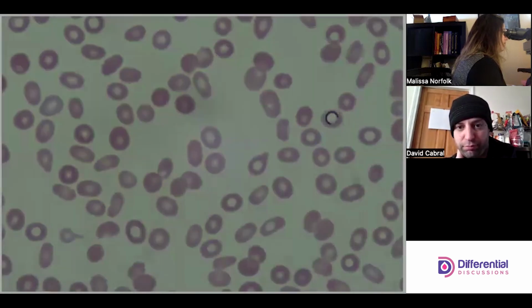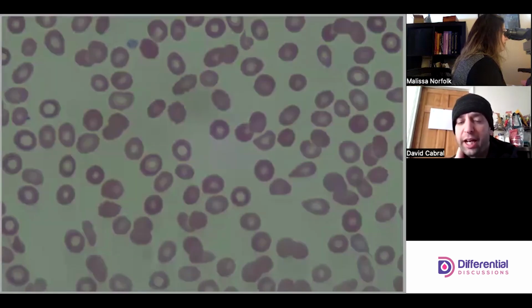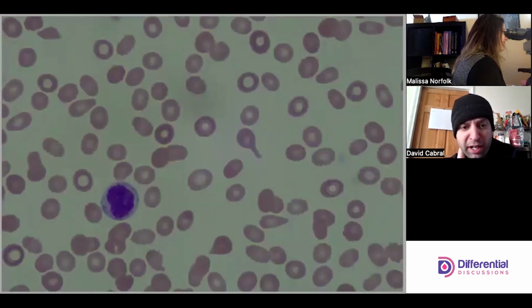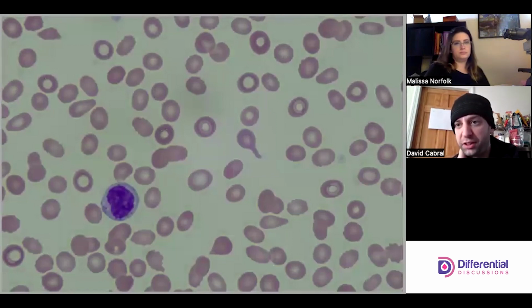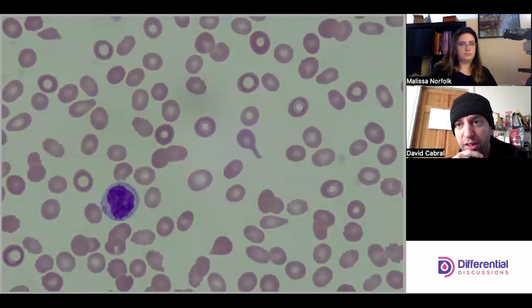So if you're undecided, let's paint a scenario where you don't see very many malignant cells and you're not sure what's what. I would encourage individuals to communicate with the clinical team, get some coag results. So we talked about DIC. If we do have a DIC, we'll have a prolonged PT, prolonged PTT, decreased fibrinogen, and a positive D dimer value.